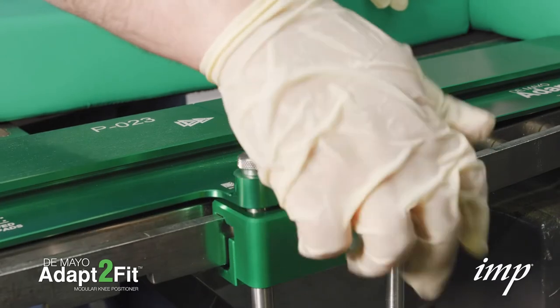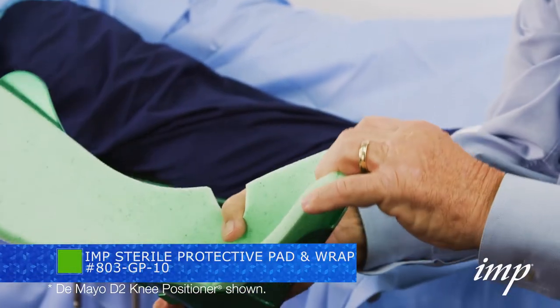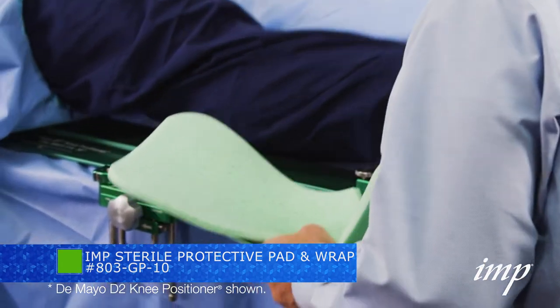Tighten the knob of the quad clamp. Insert an IMP patient protective pad into the sterile boot. For the patient's safety, always use IMP patient protective pads.